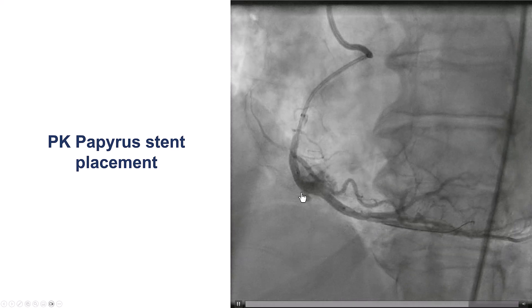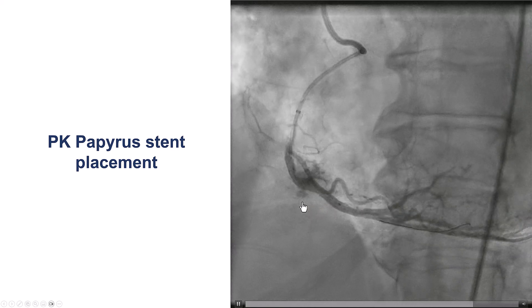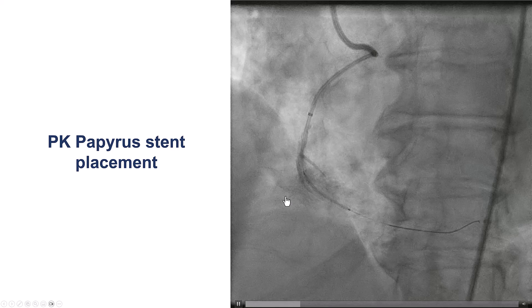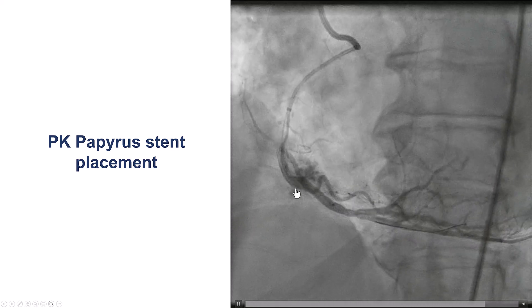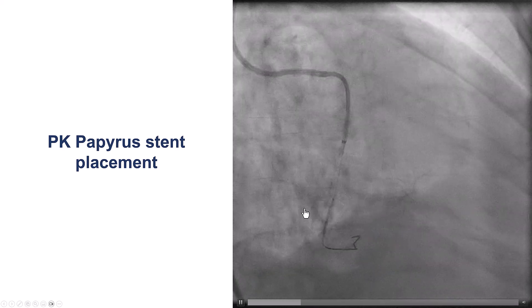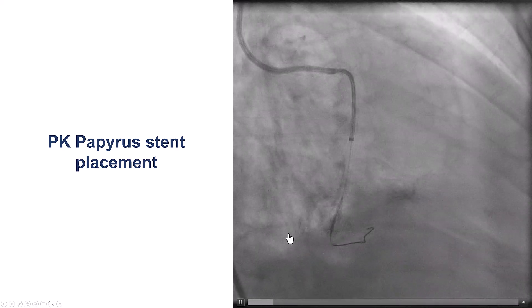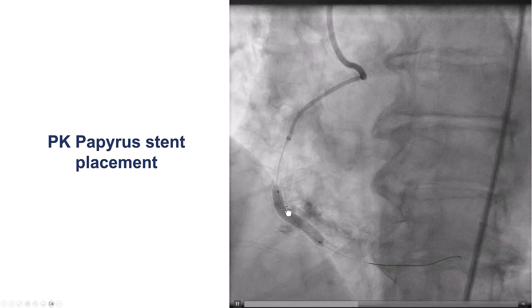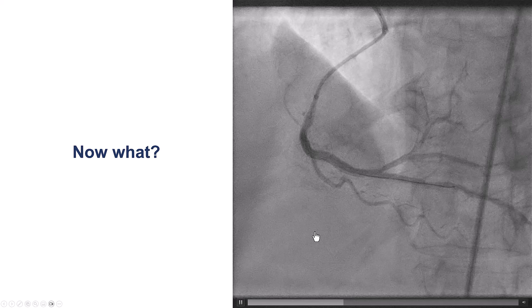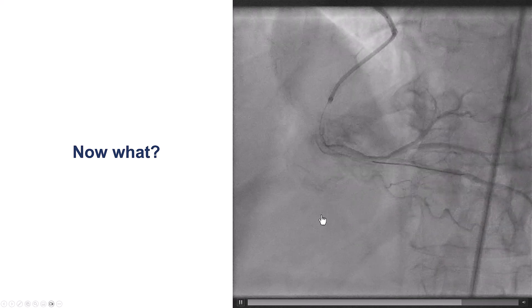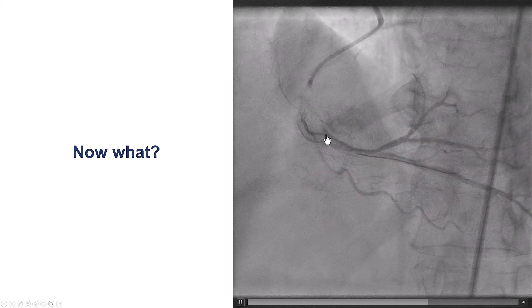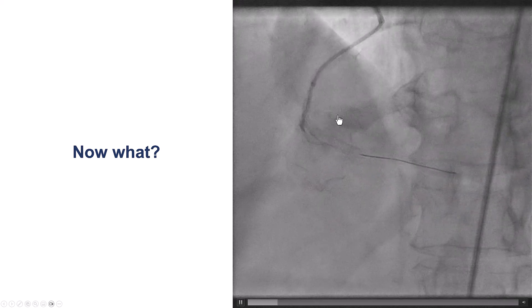We positioned the stent according to where we thought was the exit from the vessel — right around the thicker part of the vessel where we thought the extravasation was happening. We looked at it from a different projection, and it looked like we were across that area of extravasation. We deployed the PK Papyrus 3.5 by 26, but to our disappointment, although it was better, we still had some contrast seeping through the vessel wall.